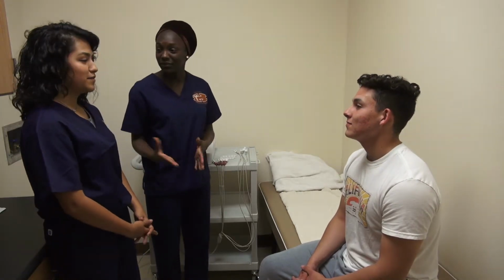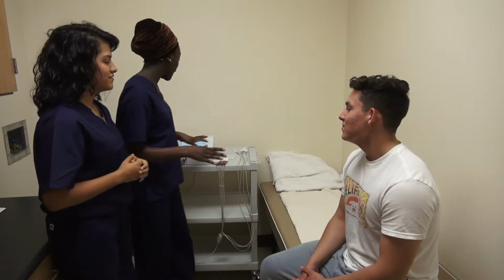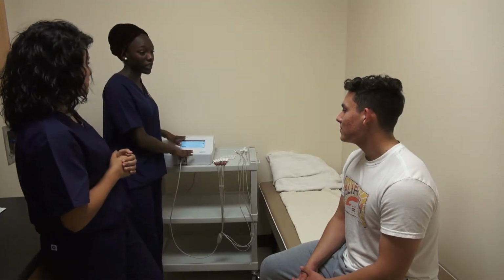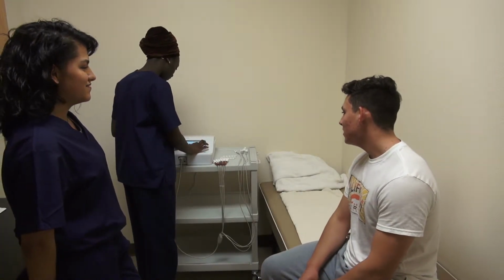Now we're going to be showing you guys a visual representation of how to do a 12-lead EKG on an actual patient. Hi, my name is Esperanza Jada, and my name is Arlie Carrion. Today we're going to be doing a 12-lead EKG on you. I would like to begin with entering your information into the EKG machine. Can you please state and spell your last name for me? Rogers, R-O-G-E-R-S.